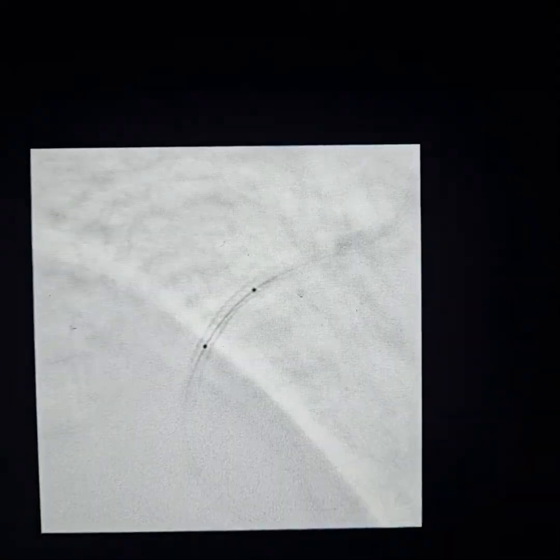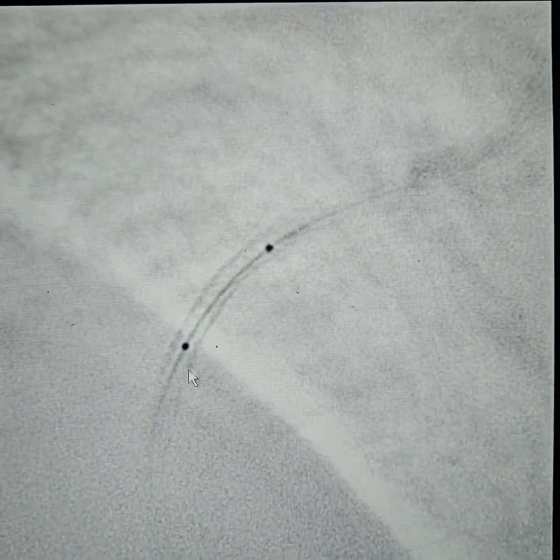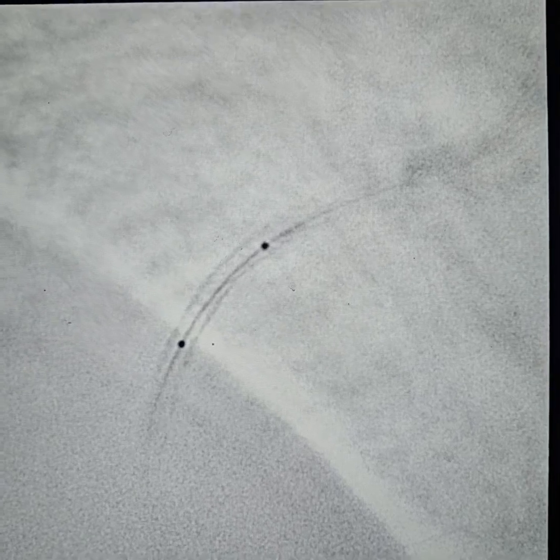After this, it has opened up very nicely. At our centre, we are always very aggressive about post-dilatation, and we do post-dilatation in primary cases as well. This is the stent boost — the stent has opened up very, very nicely, as you can see here.